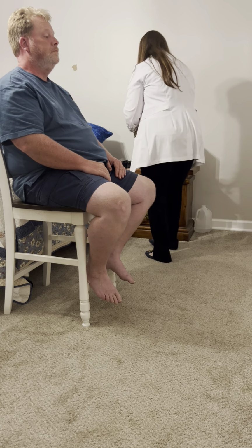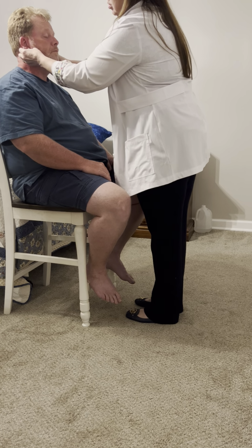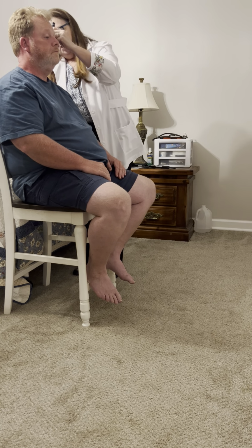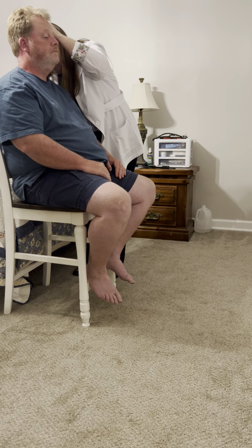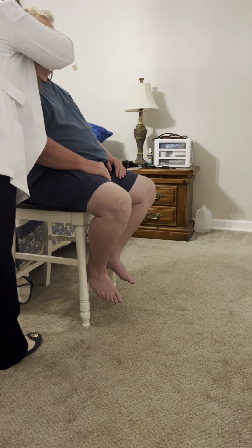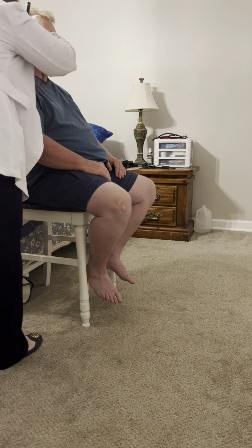Okay, we're going to look in your ears. First, I'm going to palpate your ears. Palpate the pinnae and the tragus, any tenderness. Ears are symmetrical. Look inside. Tympanic membrane is pearly gray. Cone of light is 5 on the right. For adults, you bring the ear up and out. Tympanic membrane is pearly gray. Cone of light is 7 on the left.